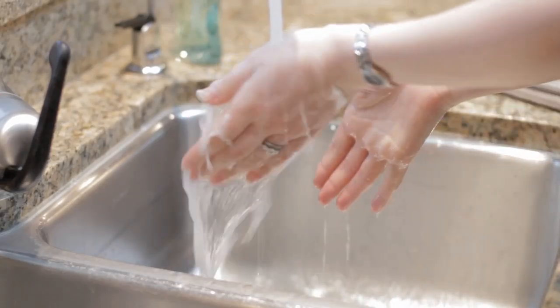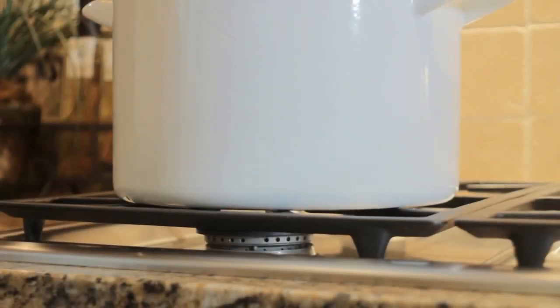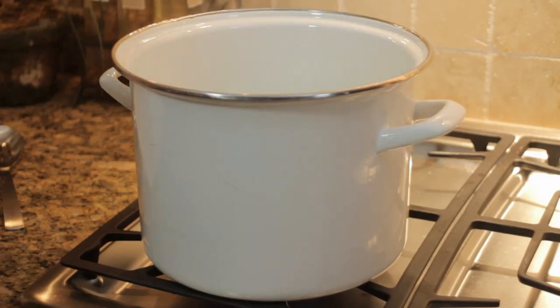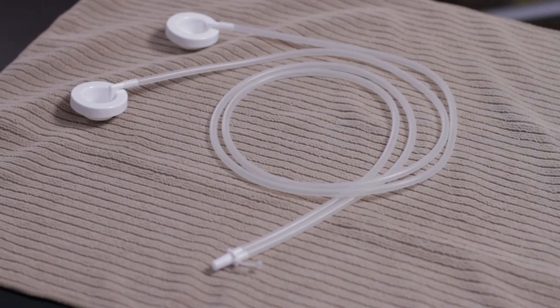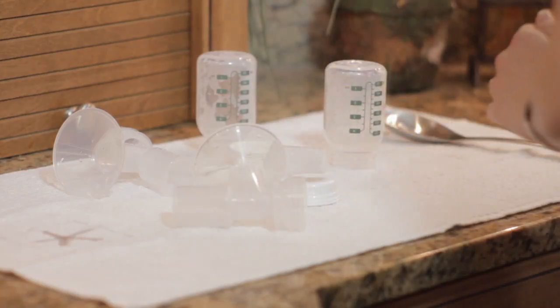Your Ameda Hygiena Kit comes preassembled. If it's marked sterile, you may use it right out of the package. If your Hygiena Kit is not sterile, before using it for the first time, boil those parts of the system that come in contact with your milk for 20 minutes to sanitize them. This includes all parts of the collection kit except the adapter cap, tubing, and tubing adapter. After boiling, let these parts air dry.